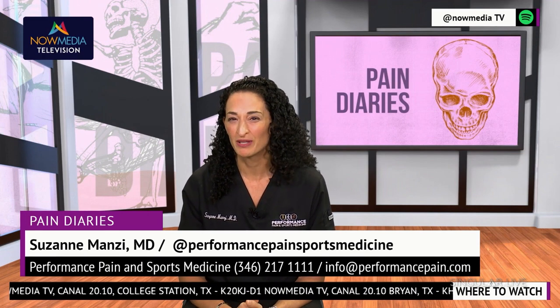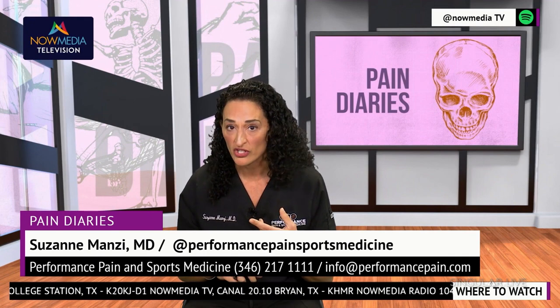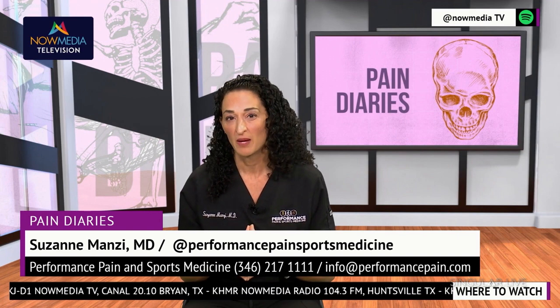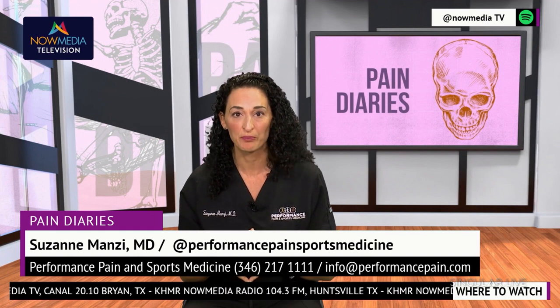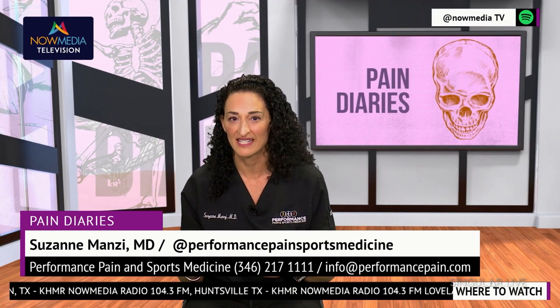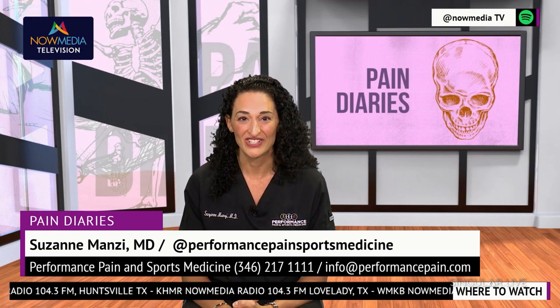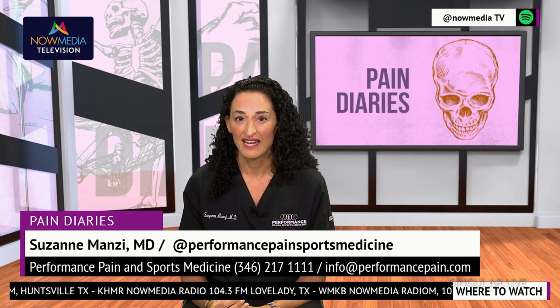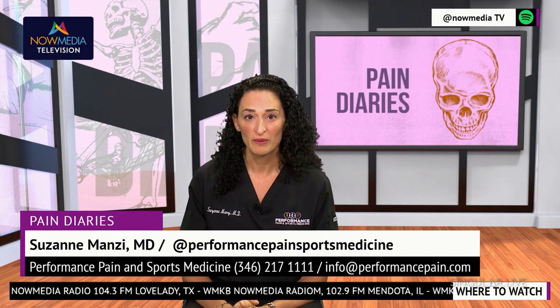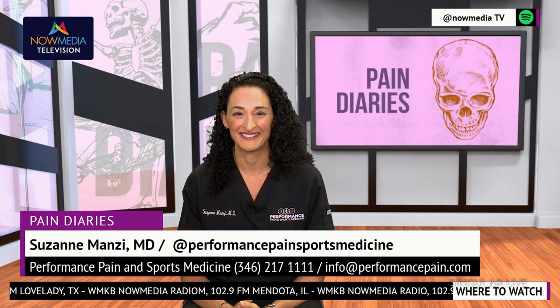Spinal cord stimulation can be used to treat various conditions that cause chronic pain, such as failed back surgery syndrome, complex regional pain syndrome, and neuropathic pain. Most recently, it's gained FDA approval to treat diabetic peripheral neuropathy, which is a painful burning sensation in the feet. It's also used for non-surgical low back pain in the more recent years. It's commonly used to treat chronic pain in the arms and legs, as well as other areas of the body. In Europe, it's even approved for some other indications, such as treatment for chronic angina or chest pain.